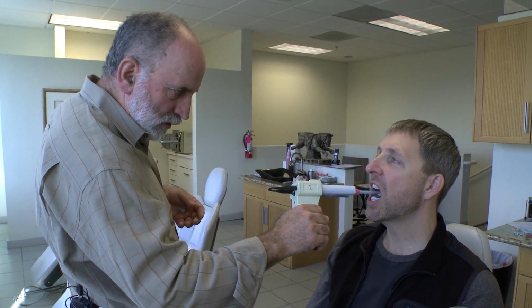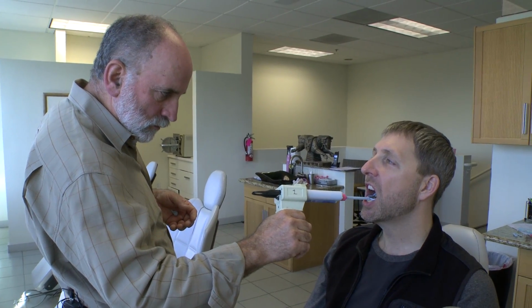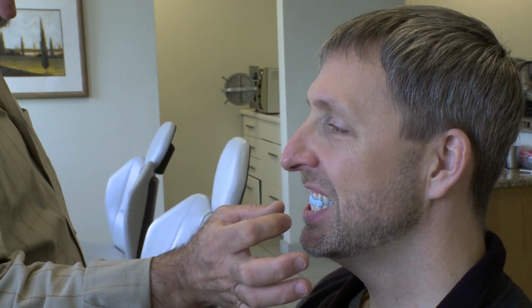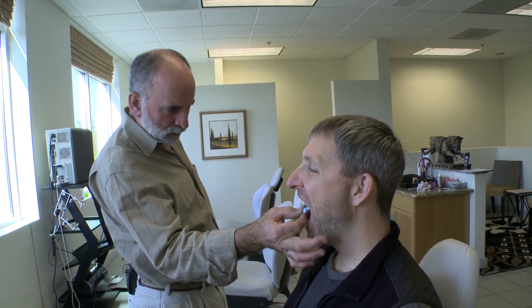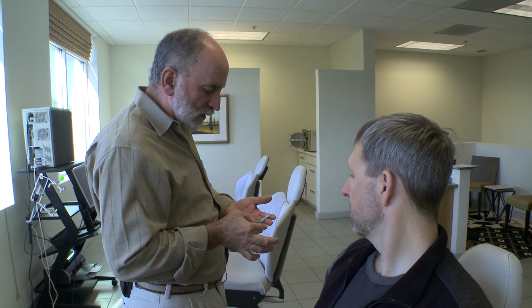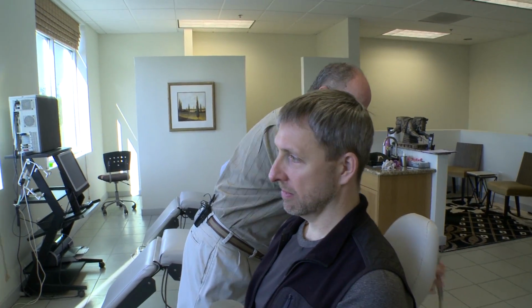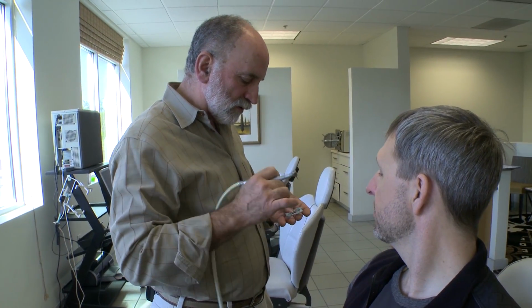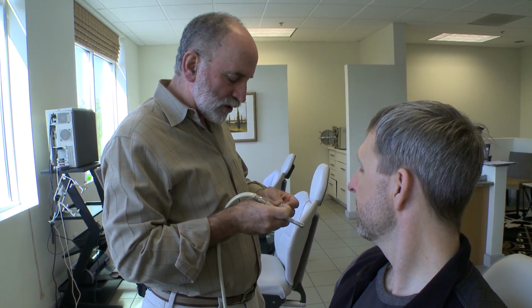So we go through lots of tubes of blue goop. Bite. Yeah, let that set up first. Don't touch it. Yeah. Good. When you put this blue goop in there, it also deprograms their brain a little bit, and so they can find the ideal bite better. It reduces your avoidance mechanisms for shifting your bite.